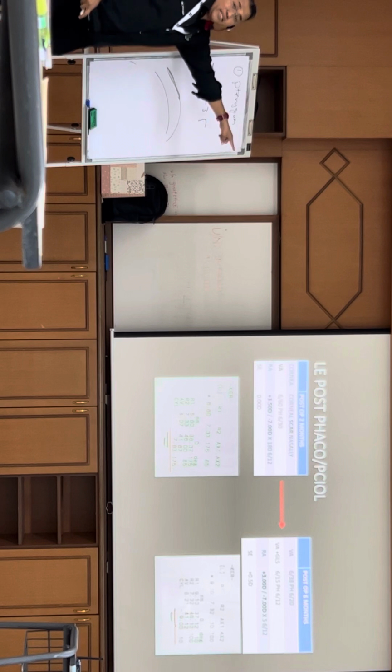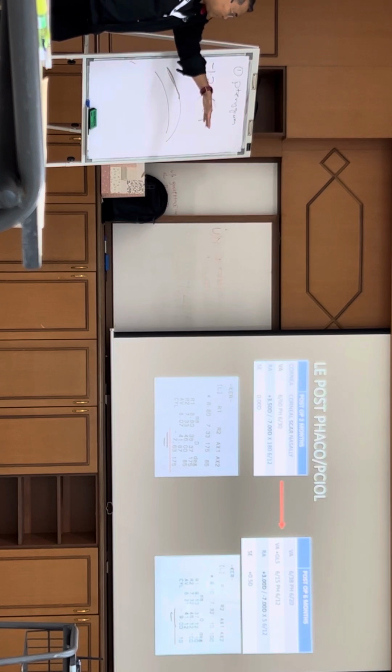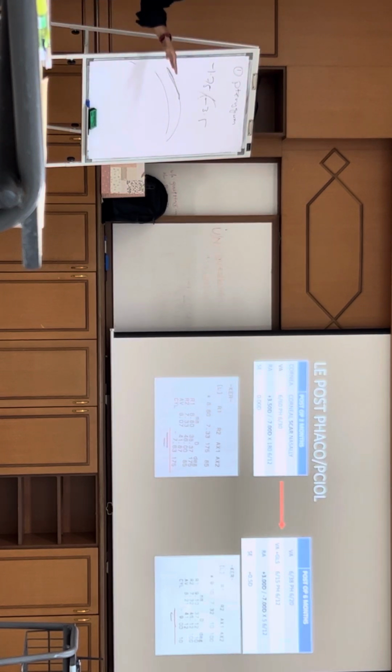So it's not surprising that you get that minus 7 because it's monofocal. You get that, and then you have a shift of this. Now that you understand, that is expected. If, let's say, we don't do anything, then it's expected that the patient will have this. So now there are a lot of questions people ask.